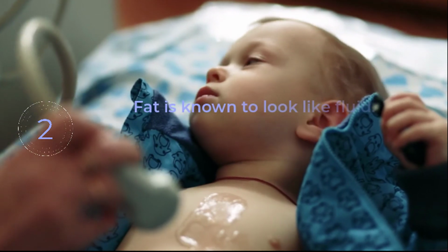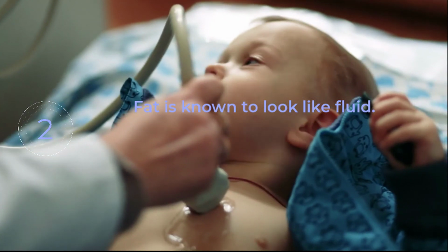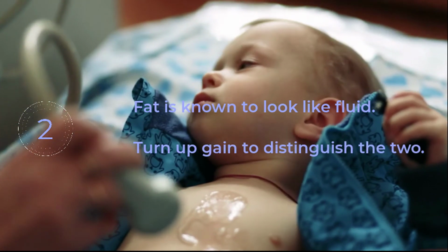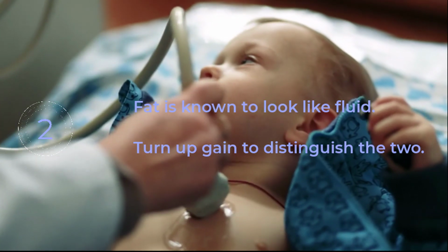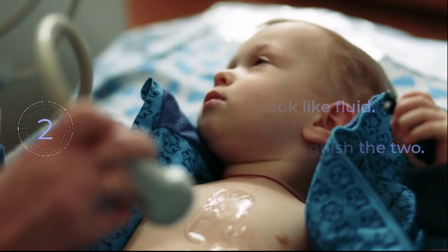Though fat is usually seen as relatively bright or hyperechoic, there are some locations in which it can be dark, thus confusing the operator and suggesting fluid. Known locations of occasionally hypoechoic fat include the perinephric and pericardial spaces. Turning up the gain makes the fat marble, unlike fluid.